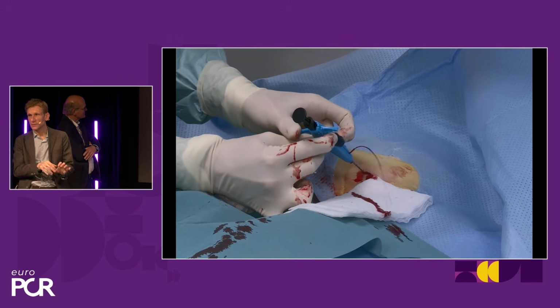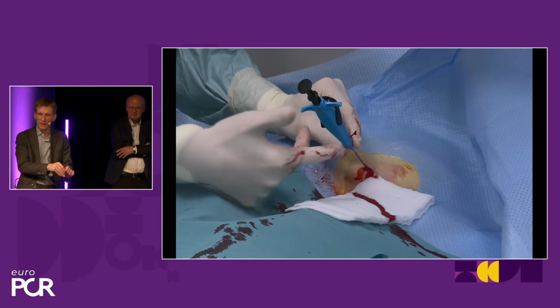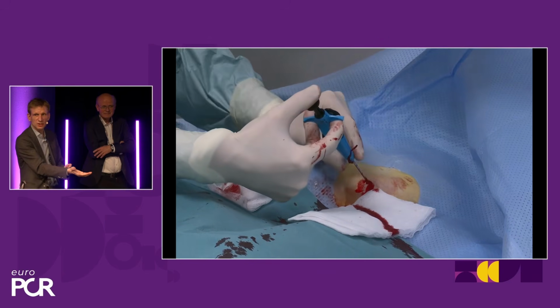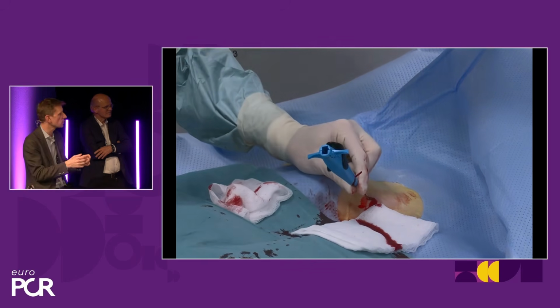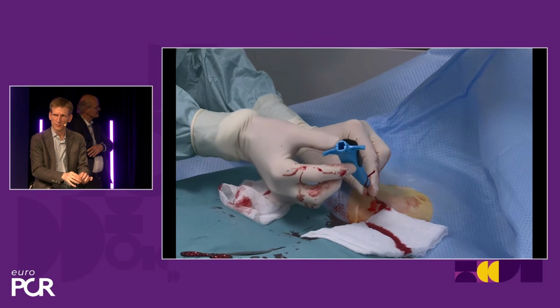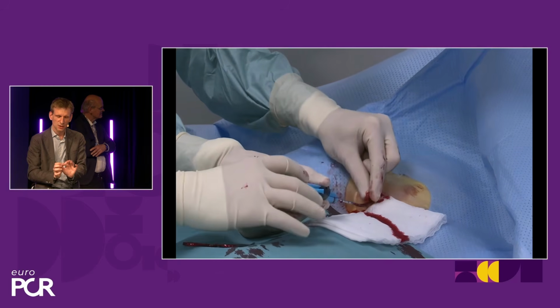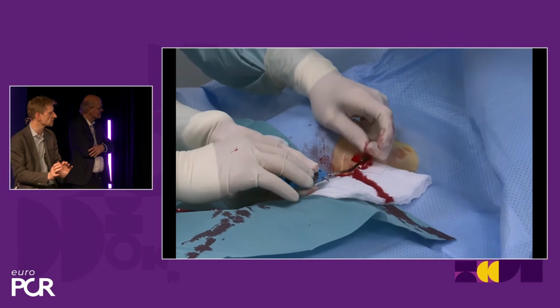Also don't go too deep, because some people go too deep: they see the bleed back, but they keep on going. If you're then too deep and you open up your foot plate, your anchor, you may risk catching calcium further down the road. It's not the purpose that you see blood coming back and go many more centimeters deeper. You advance slowly, and as soon as you see the bleed back on the side, you advance just a couple of millimeters, typically 5 to 10 millimeters maximally, and you stop there.